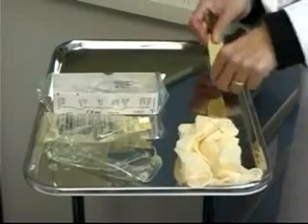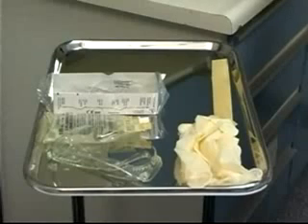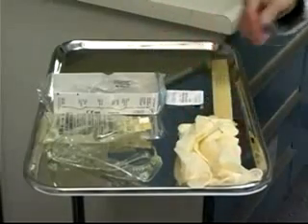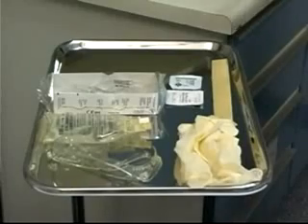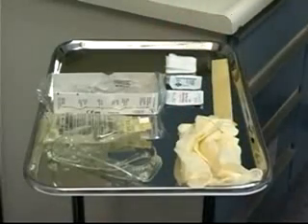We'll use a tourniquet to wrap around the arm to help us determine which vein will be best to use. Once we've done that, we need to clean the area, and in order to do that, we're going to use first Povidone iodine. And once that's dried, we'll clean that off using a plain alcohol swab. We're going to have a small piece of 2x2 gauze to help clean up any messes that we might make.